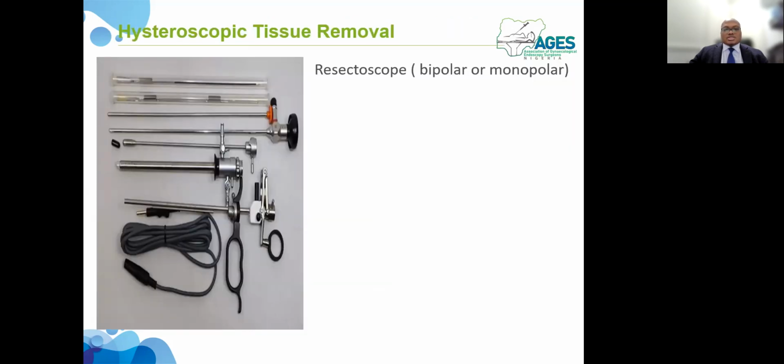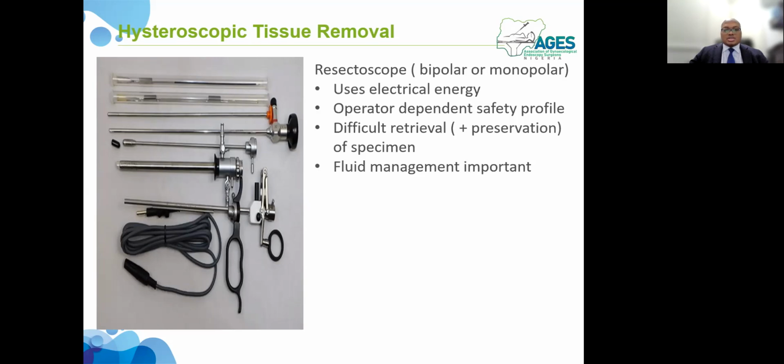Regarding tissue removal system, the traditional resectoscope, which could either be bipolar or monopolar, can be used. They require use of electrical energy. And as mentioned previously, the safety of these devices are operator dependent.